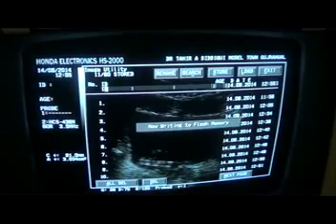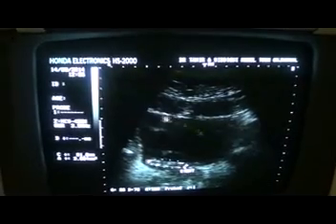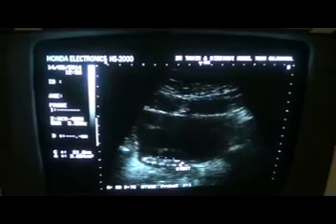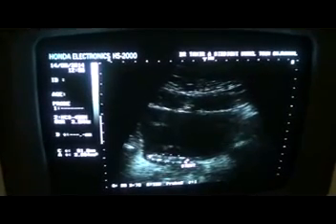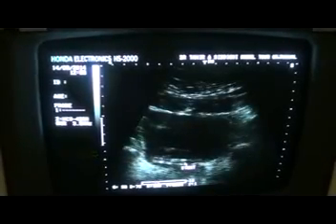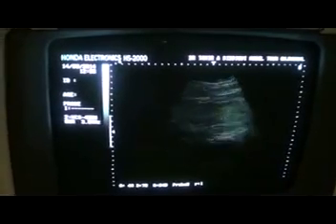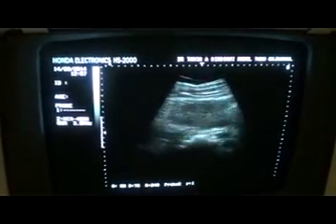pathology. Otherwise, you see that the urinary bladder is normal, with no calculus, walls are thin, and no debris is seen in it. So the urinary bladder itself is so far having only a stent placed with no other finding. Now let's move to the right kidney and see what is the situation over there.